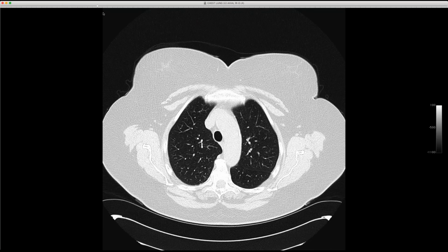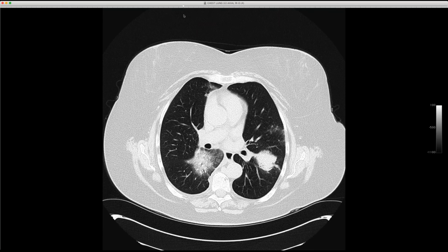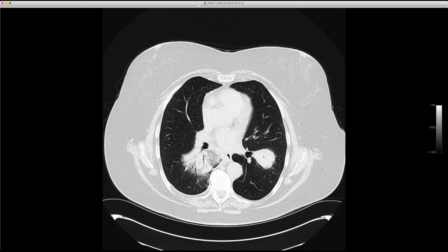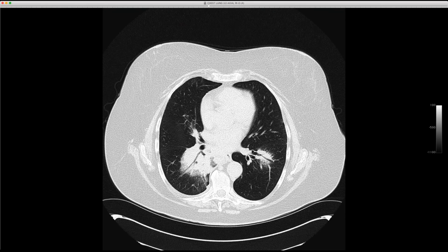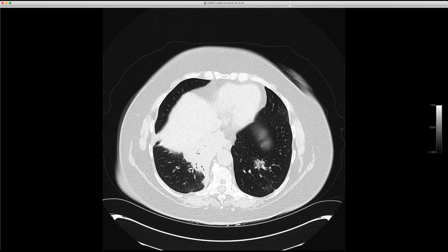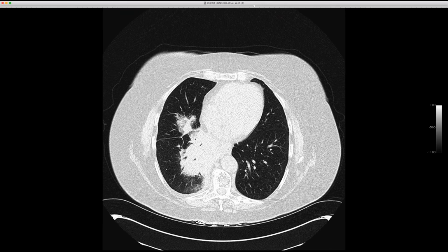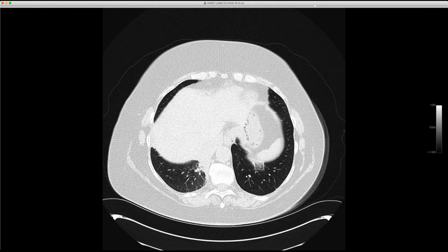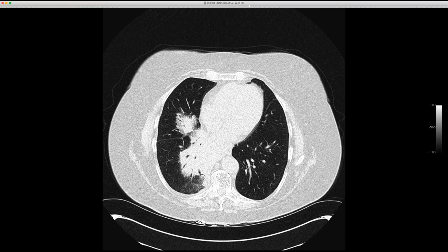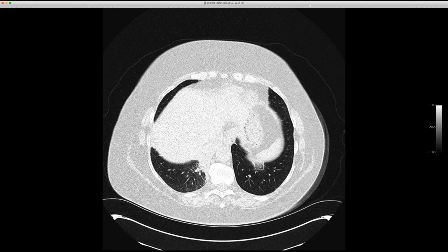Yes, and here's her CT scan. And you'll see there are these very well-defined consolidated masses with some ground glass on the periphery, patent airways that go right through them. So the masses are very much in a peribronchial distribution, very well-defined, sharp margins. So, you think of things like organizing pneumonia, infection, but again, she's asymptomatic. And one of the other things I like to think about when I see these things with air bronchograms and they sort of fade but have still very distinct margins is pulmonary lymphoma.